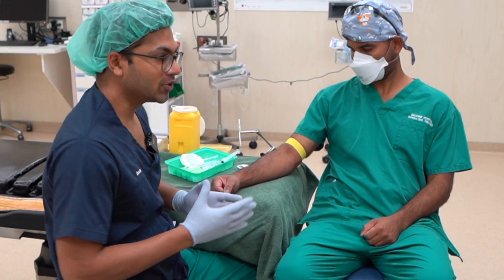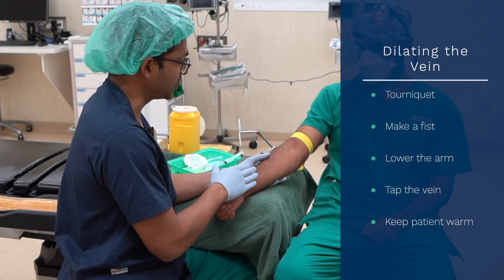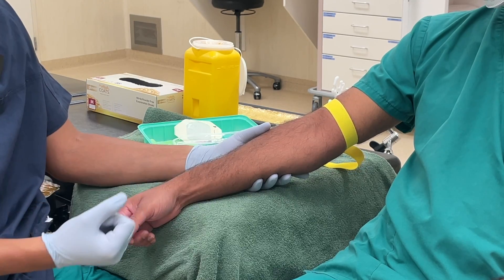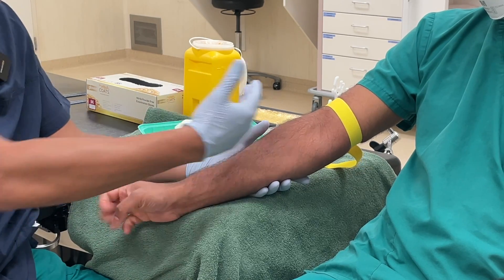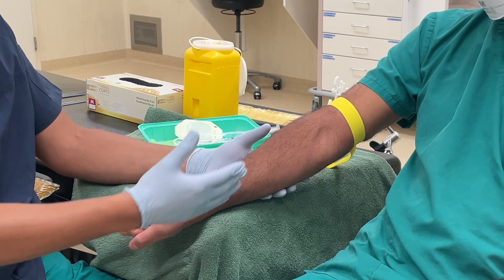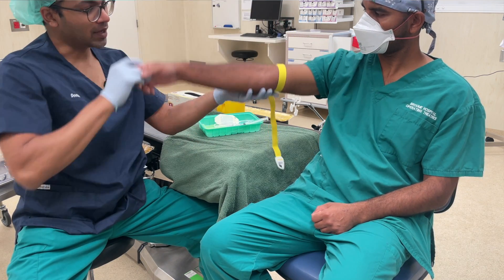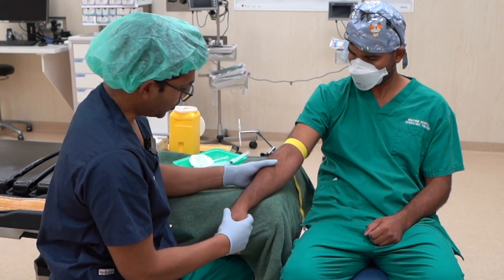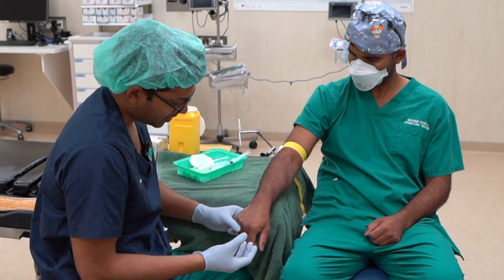Now I'm going to do all the usual things to make sure that the veins on the arm stand out as much as possible, because again I don't get a lot of visual cues in a darker skinned person. That means making sure the tourniquet is appropriate and getting a bit of muscle activity going — I'll get my patient to make a fist, opening and closing their hand. That increases metabolism, drawing more blood to the area and increasing venous pressure. I might also use gravity, making sure the arm is low, as a hydrostatic pressure gradient increases pressure in the lower veins. You can also use tapping, which increases vasoactive mediators and dilates the vein.